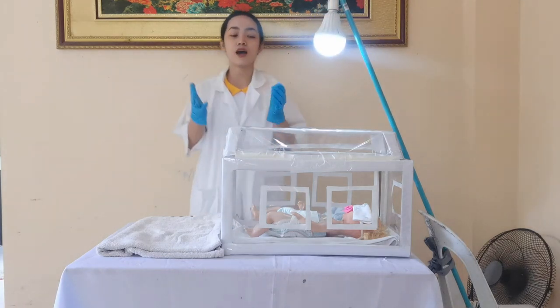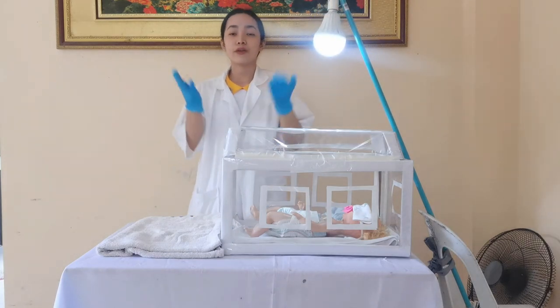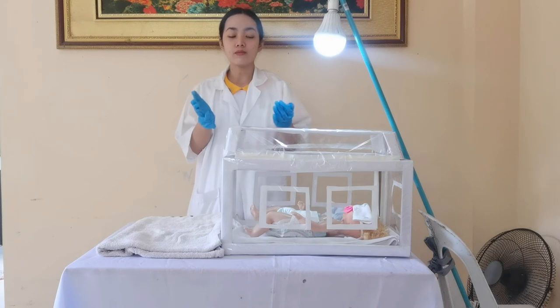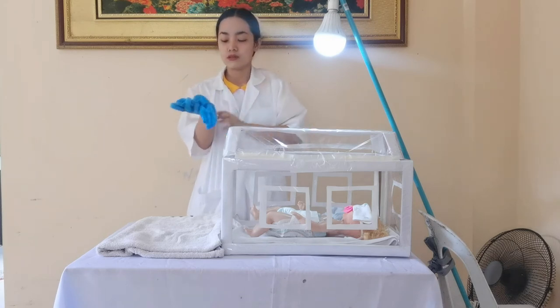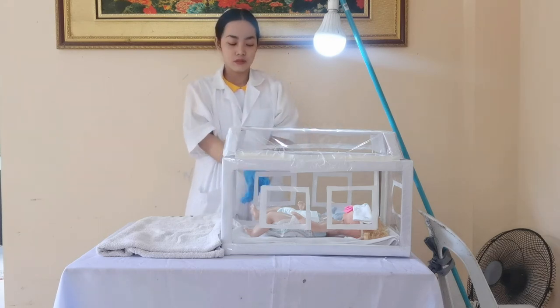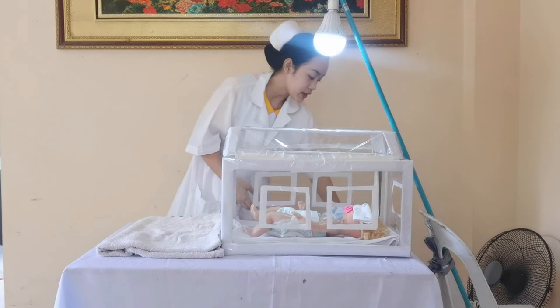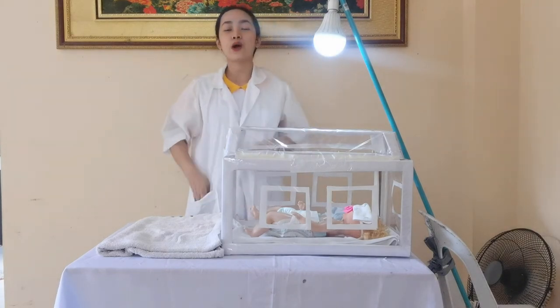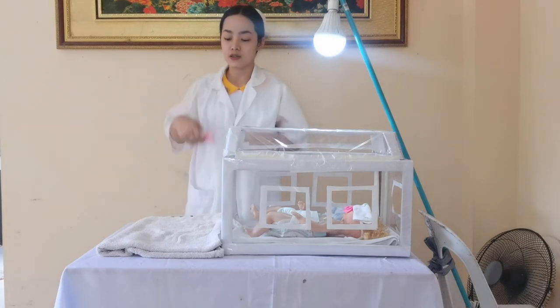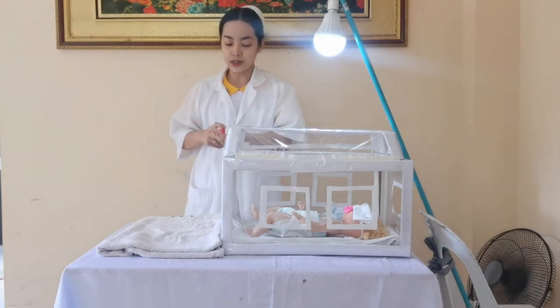Now that we are done, we will remove our gloves, dispose of them properly, and do hand hygiene to prevent the spread of microorganisms.